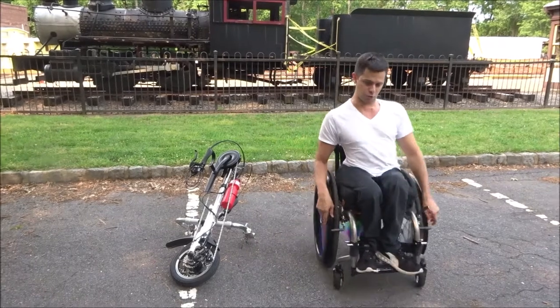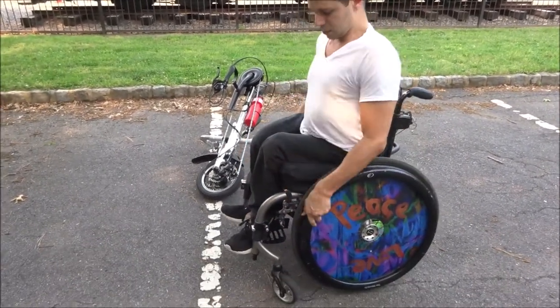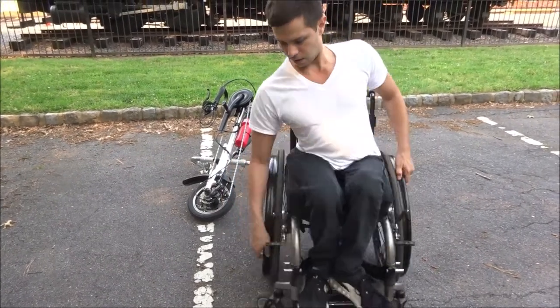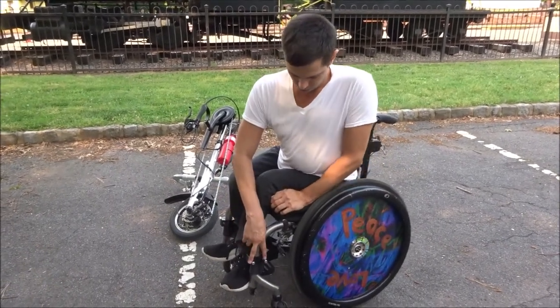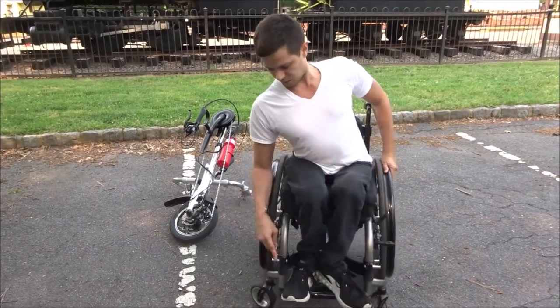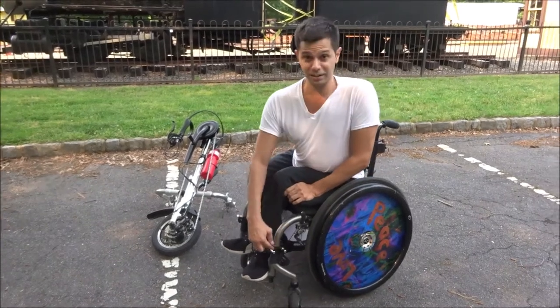Alright, so I'm going to get a little closer to show you. If you can just focus down here, you need to put this one here and one here on the front of your wheelchair, because these two prongs — I guess you could call them — and these two on this side are what the attachment actually attaches to.